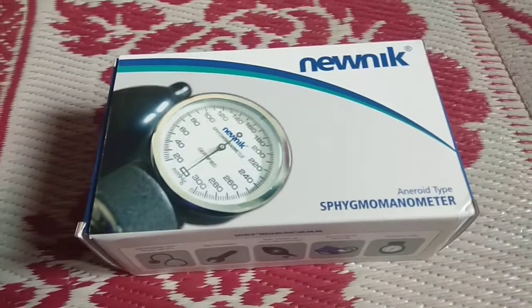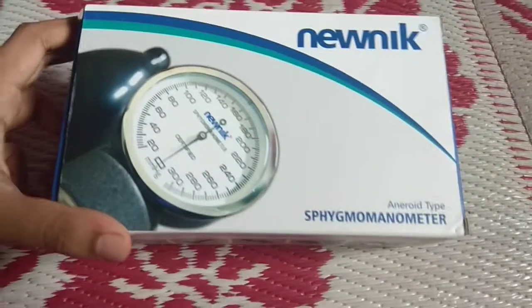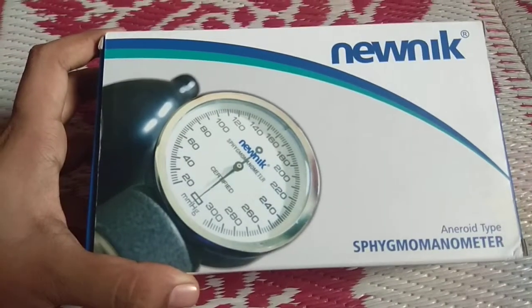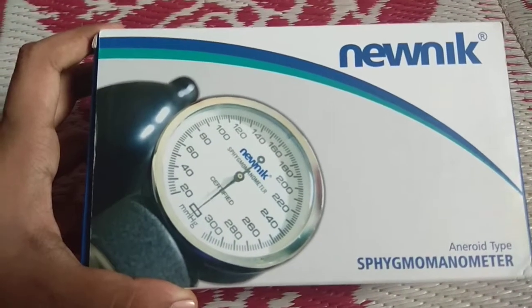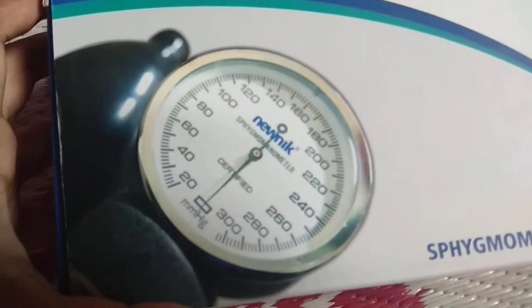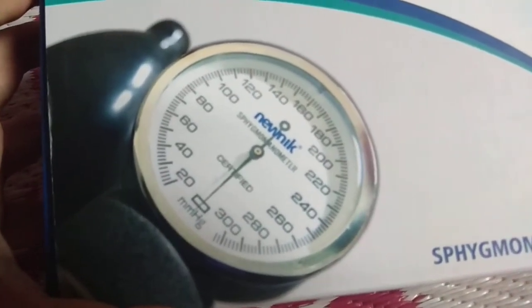Hello there guys. We are going to unbox the Spigma Manometer from Newnik. As you can see from the packing, it can read up to 300 mm of mercury.